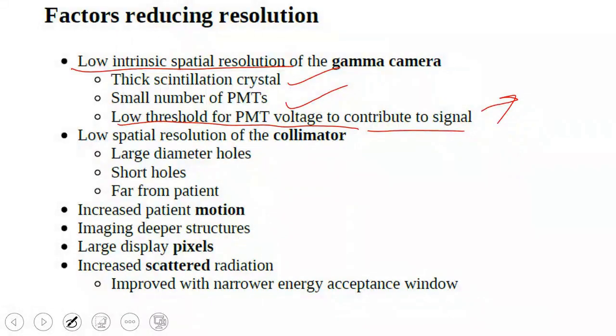We were discussing the photomultiplier tubes, which, after receiving the light photon that reaches the photocathode, transform it into an electron in a seamless process. Ultimately, this is sent to the preamplifier, which converts it into an appropriate voltage signal in a precise manner.